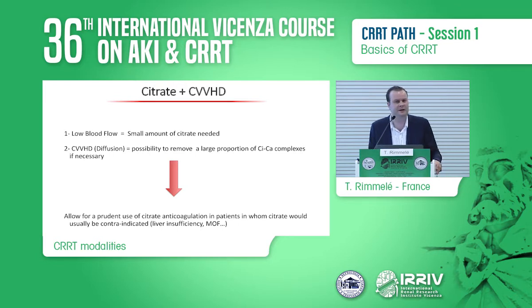I know some good teams, they never give citrate to their patient when the patient is in shock, like a severe patient in the ICU. But usually these patients, we don't want to give heparin. But if you can push the limits of the indications by doing this, then you may be able to use citrate in patients for whom citrate is usually known as contraindicated, like liver dysfunction, shock, hyperlactatemia, and several intoxications.